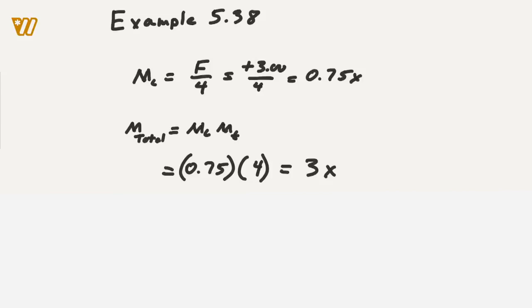So the first thing is, remember we talked about whenever you assume a standard working distance of 25 centimeters to figure out the magnification of a handheld magnifier, or in this case a reading cap, which is essentially the same thing, all you do is take F divided by 4. You take the power of that lens divided by 4. In this example, it doesn't give you a distance that you hold the material at. And so in that case, whenever it gives you a reading cap value and asks what's the total magnification, you're just going to assume a standard working distance. Unless they give you in the problem where they say you hold the material this far away from your eye without the magnifier, you're going to assume the standard working distance of 25 centimeters, and you're going to be able to use F divided by 4 for your equation to calculate the magnification of that reading cap, which is essentially a handheld magnifier.